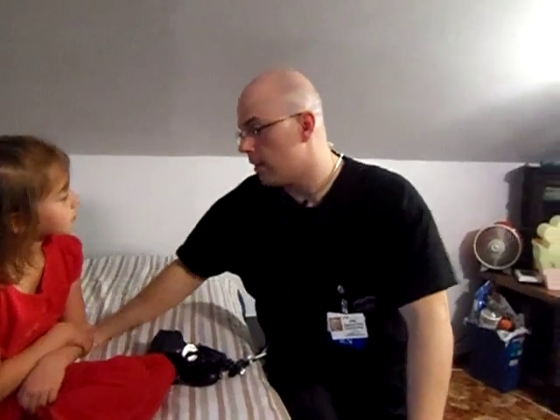So today we discussed vital signs, specifically blood pressure, deviations in blood pressure, the instruments used to take a blood pressure, and I hope this helped clarify the idea of blood pressure for you. Thanks.